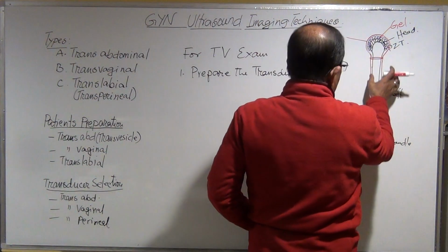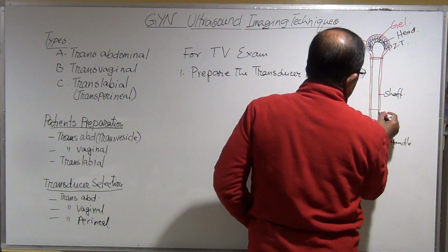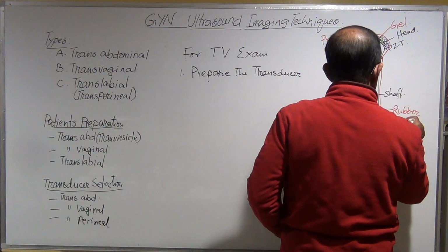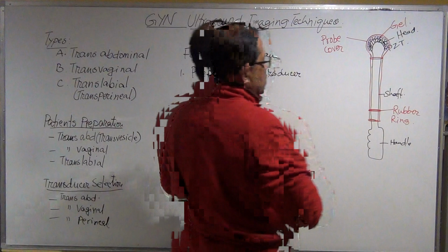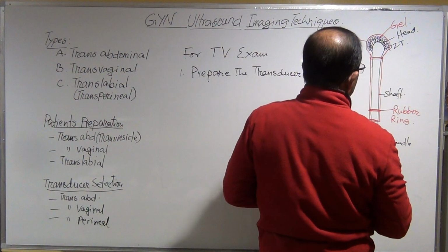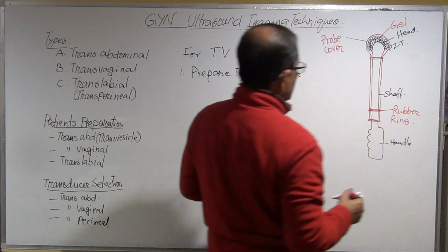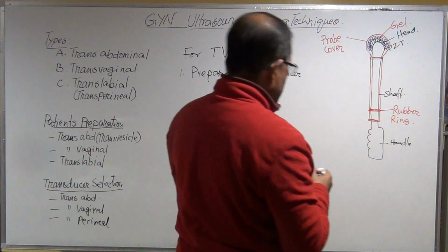And then tighten it with the shaft and put the rubber ring or rubber band. So now it is tight with the shaft. So now this probe is ready to go inside.